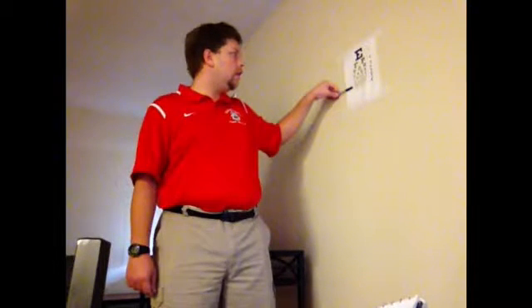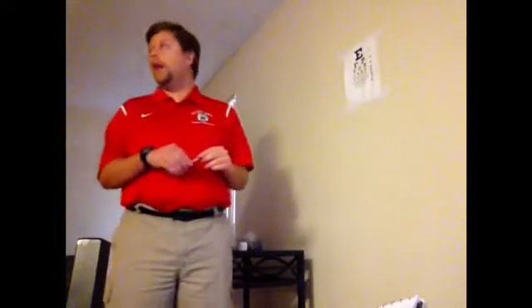PZO. Okay. And so for his right eye, there's a couple of errors on line 7, so I'm going to mark down the number that corresponds with line 6, which is 20/30. And now I'm going to have him cover his right eye, and we're going to test his left. So go ahead and cover your right eye for me.